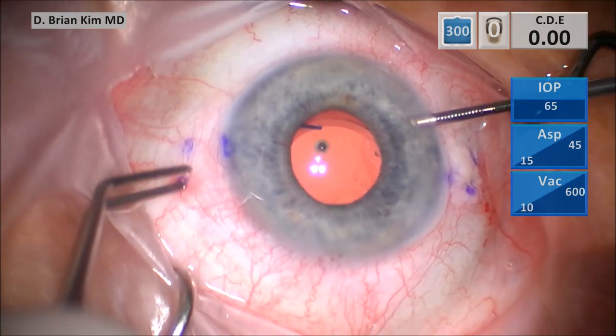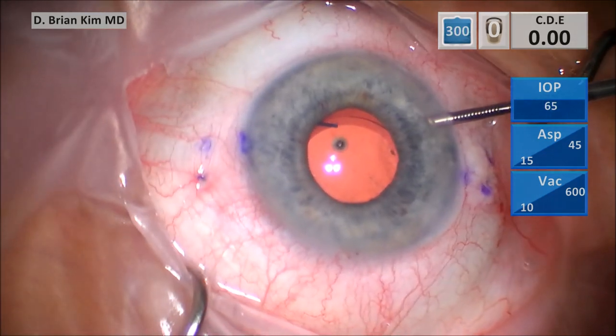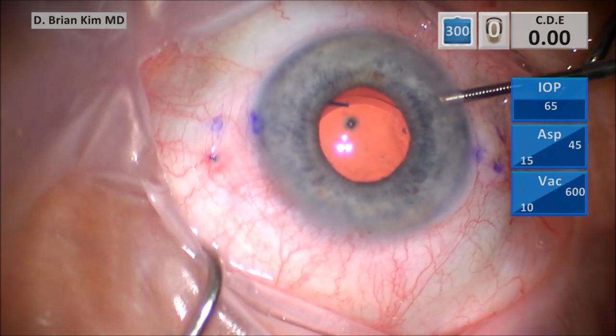So as you can see, I finished this case and I'm pushing the haptics into the sclera, and you can see that the lens is slightly decentered. You can see the edge of the optic inferiorly.